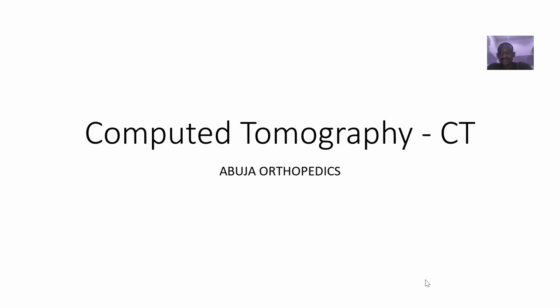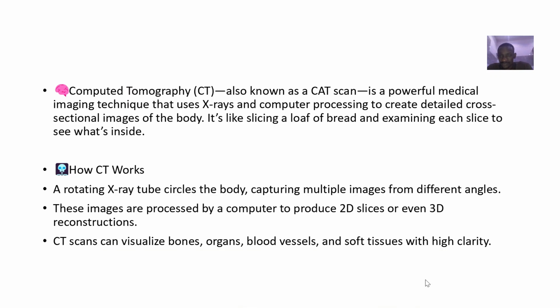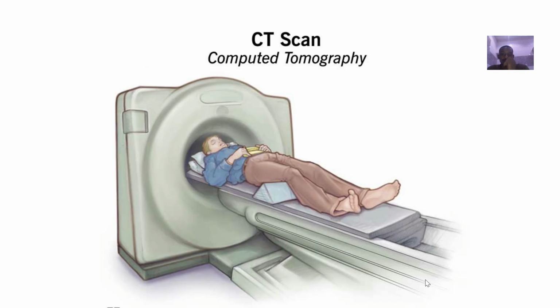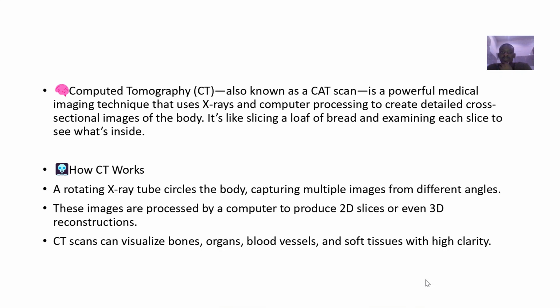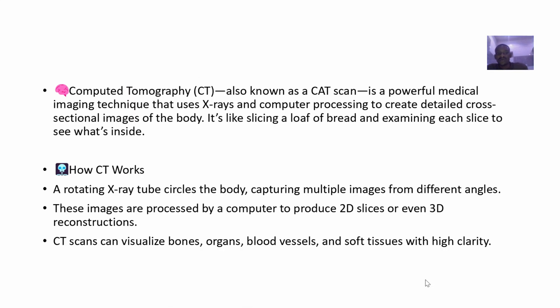So for the next, one of the most popular imaging modalities which we'll be looking at is what is known as what? Computed tomography. Right? Computed tomography. So computed tomography is also known as CT scan, is also known as what? CAT scan. Right? So it's a powerful medical imaging technique.